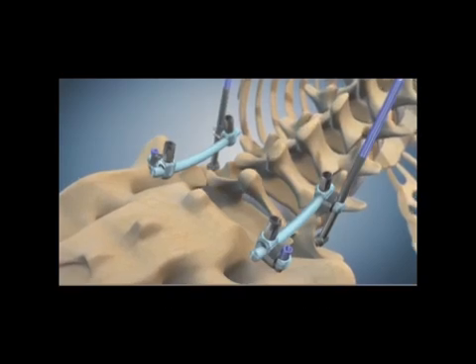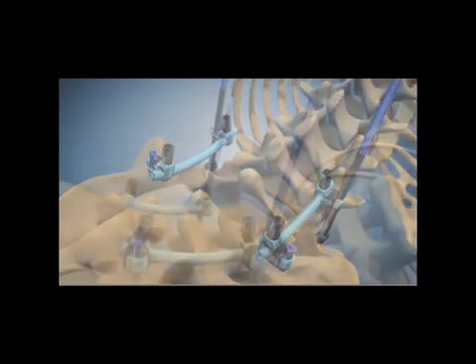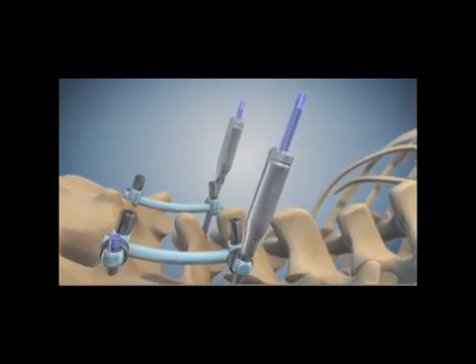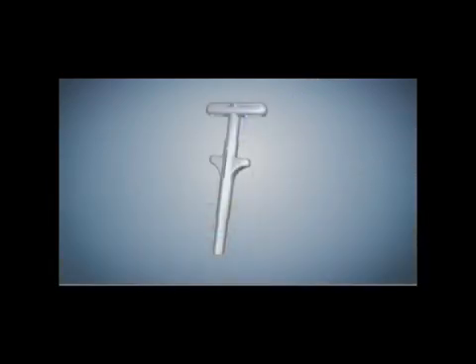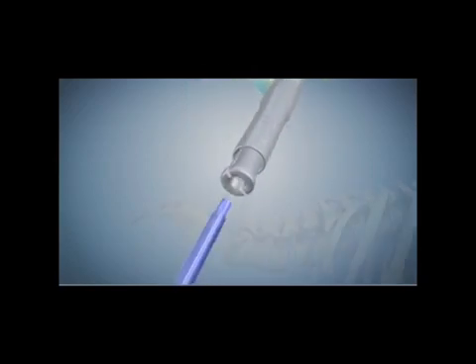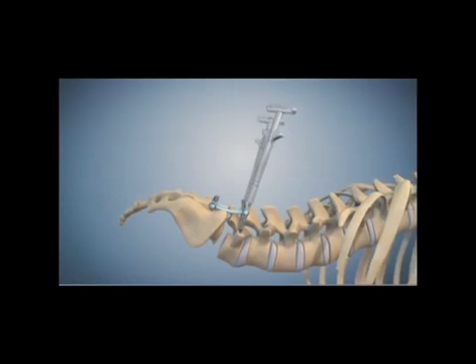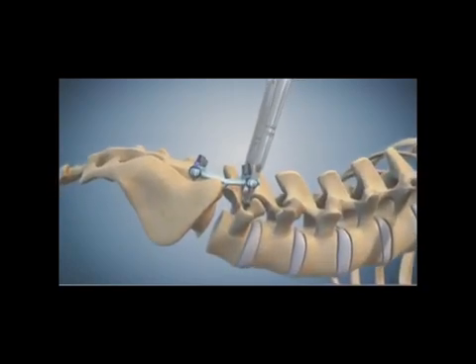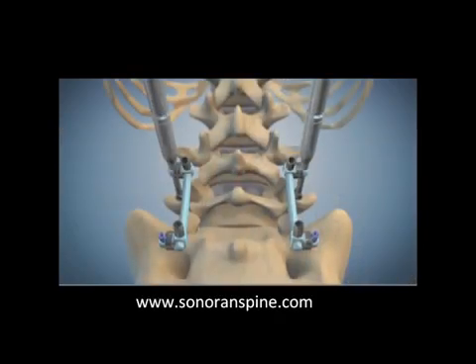That can then just be removed, and the screws are locked onto S1, forming a stable base. The unidirectional rod crimp and the quick-threaded driver are then used, placed over the reduction post, and the driver is then slowly turned, right side and left side, to pull that vertebral body back into position.